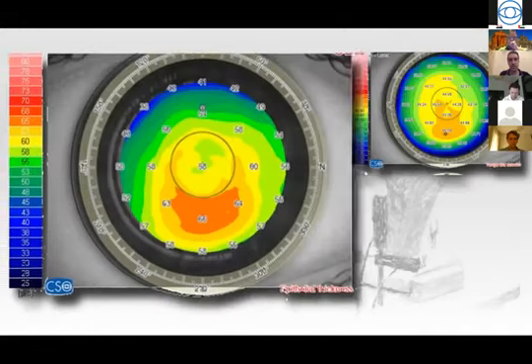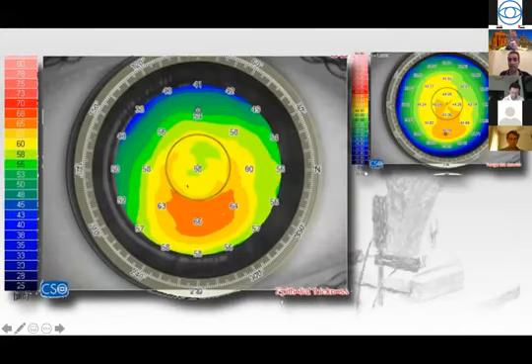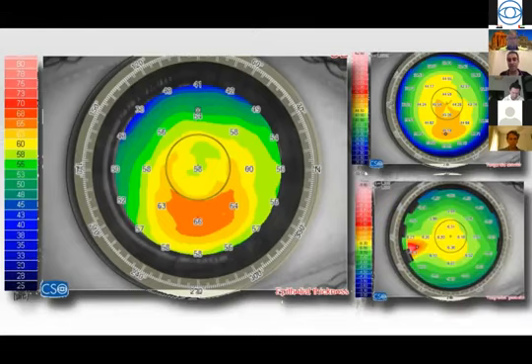Now, that's another, maybe more extreme example, where this is the anterior instantaneous curvature, and that's the epithelial mapping. This patient is not a contact lens wearer, and the patient does not have dryness. But it's amazing how sometimes the epithelium remodels, maybe from rubbing, maybe the way the patient sleeps over the right eye or so. That's interesting to compare, and that's again the posterior curvature.